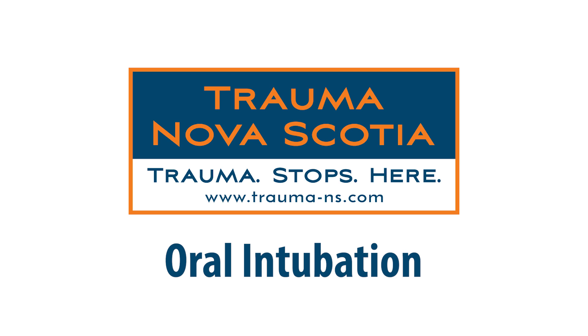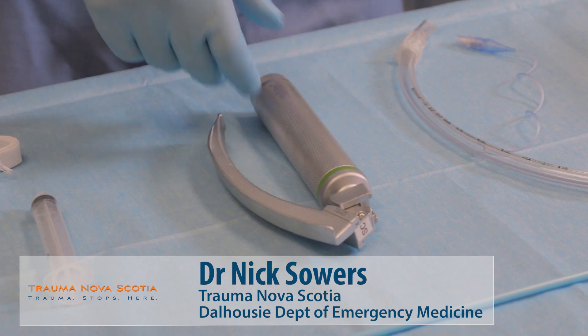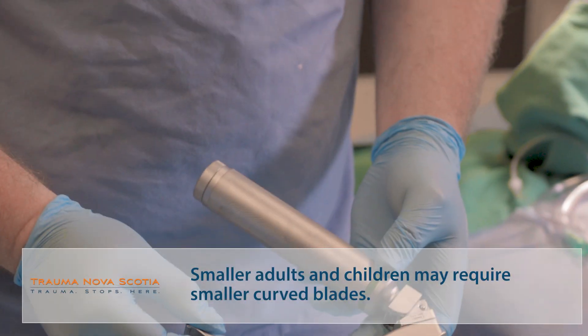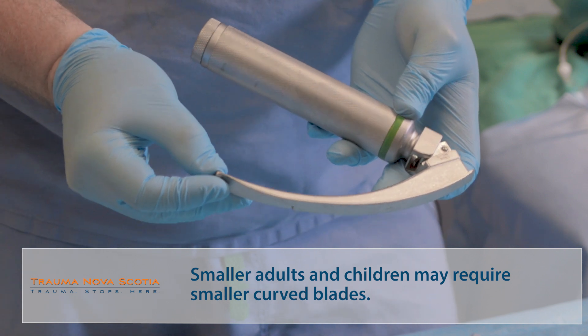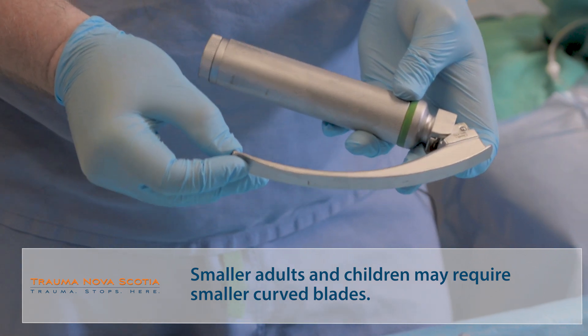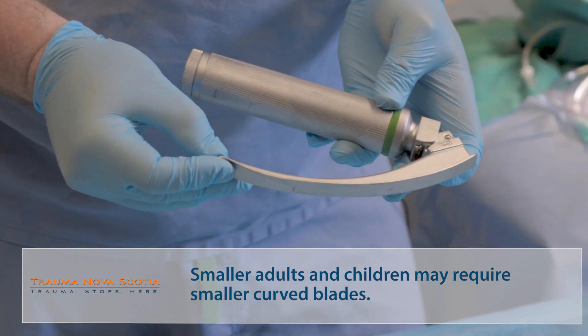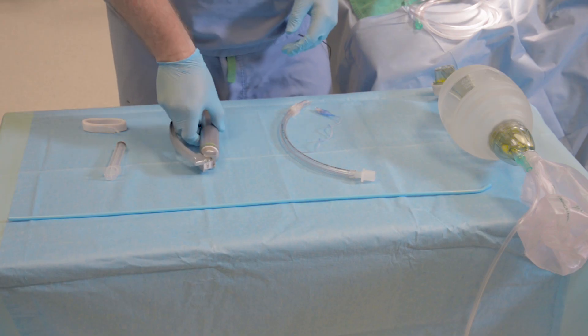Standard equipment for direct laryngoscopy begins with a laryngoscope and an appropriately curved blade. You have many options. My device of choice would be a Macintosh IV laryngoscope. Whatever device you're most comfortable training with, practicing with, and working with clinically should be the device that you choose.